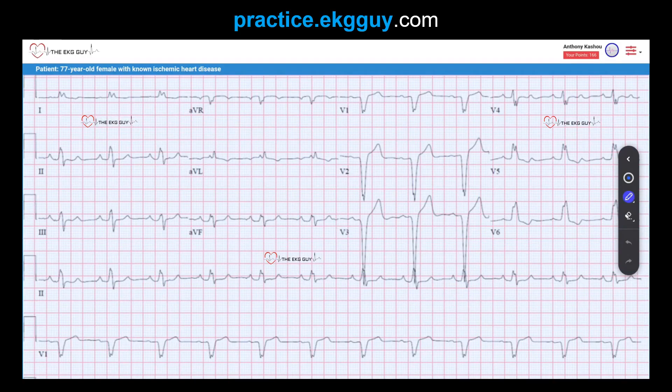Here we have an ECG obtained from a 77-year-old female with known ischemic heart disease. On initial glance, you should notice that this is a regular wide QRS rhythm. The QRS duration was 148 milliseconds, so wide. The ventricular rate was 71 beats per minute, so within normal limits. Apart from the QRS intervals, the other intervals — the QT interval as well as the PR interval — were quite normal.